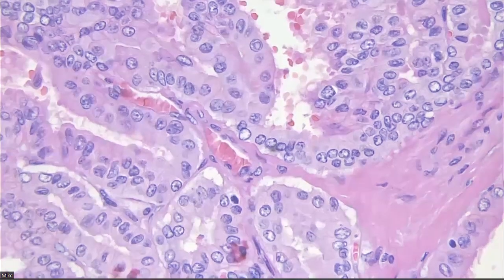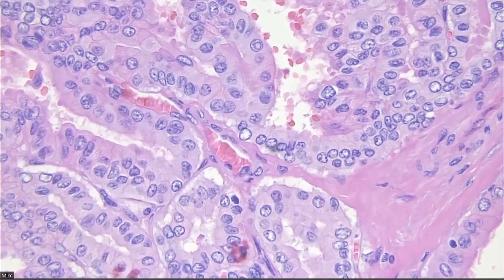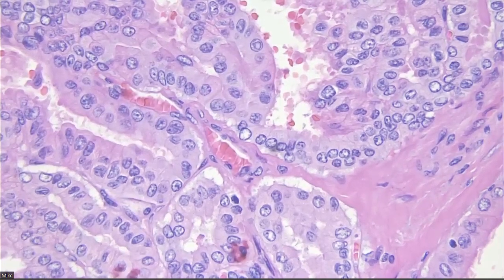So how do you define a true pseudo-inclusion? For a true pseudo-inclusion, you should see the cytoplasm, which is pink in the cell, right? Then the outer nuclear membrane, then chromatin, which in this case is kind of palish blue.